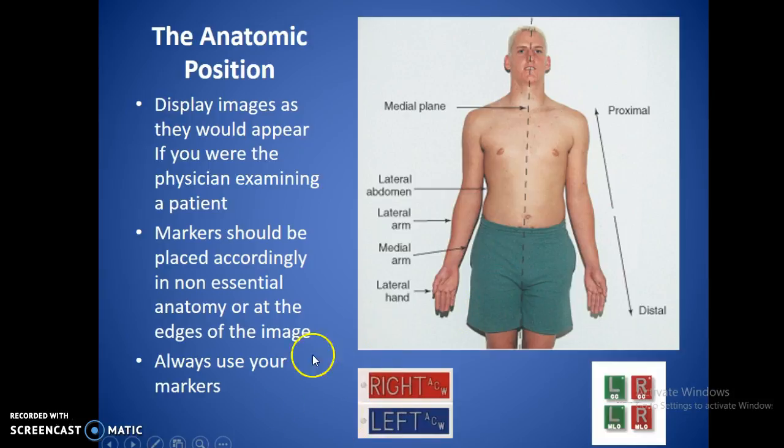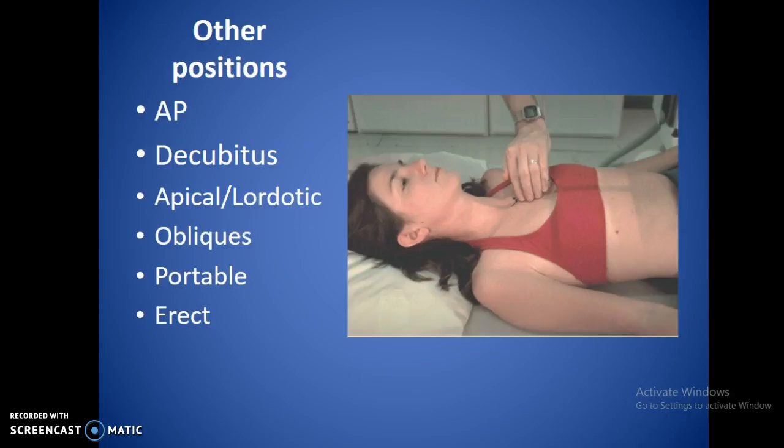Make sure that you get your markers from your clinical instructors. You're going to use these markers. They need to be on every single image that you do. It's unacceptable not to use your markers or to have them coned off or outside of the field where you can't see them. There's some other positions we'll be looking at.